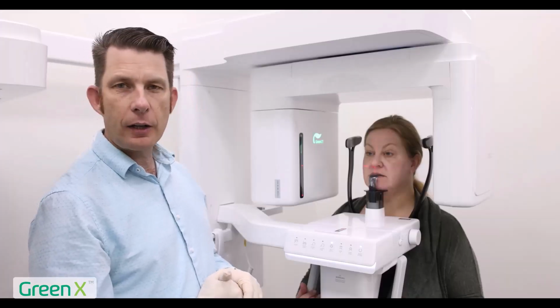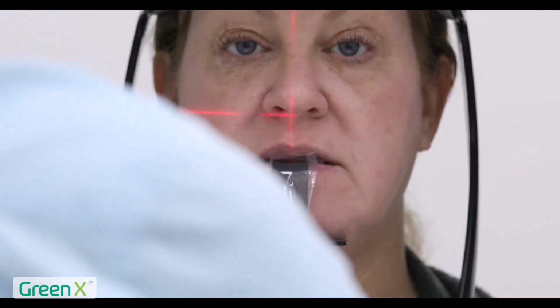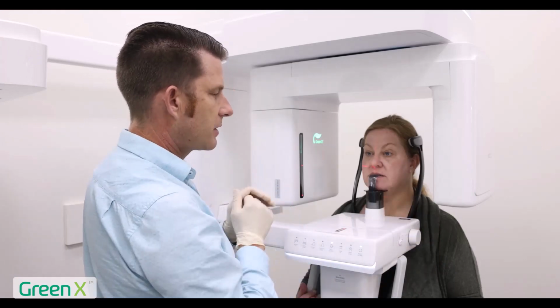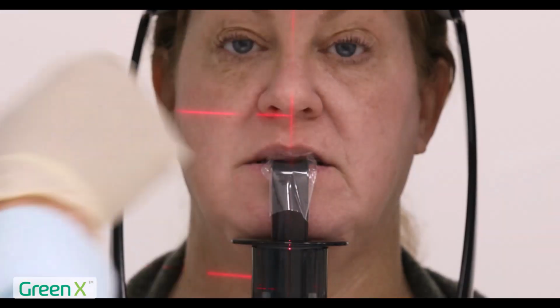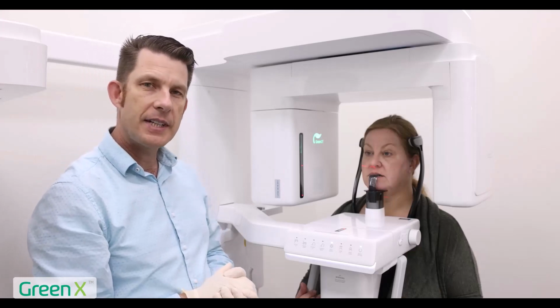Next, I'm going to go ahead and close my temple supports. I want to make sure this is tight, so I turn it a couple extra times to ensure that the patient does not move. I'm going to adjust our patient's head a little bit to make sure they're lined up center. Mid-sagittal beam right between the eyes and right through the philtrum. And now we are ready to capture our CBCT.